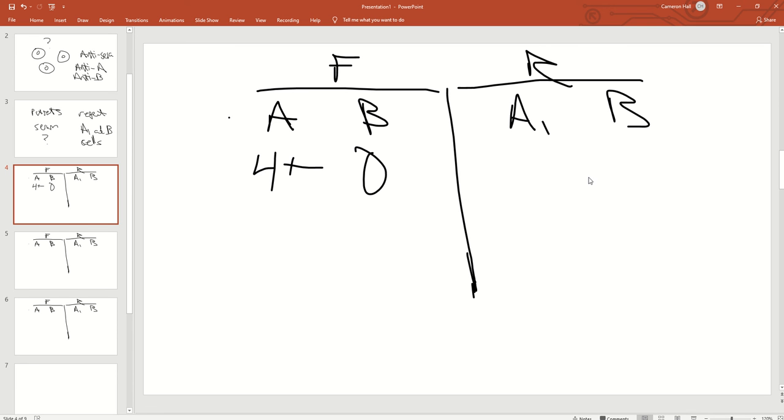Well, let's break it down. So 4+, like I said, means we saw agglutination. So what did we do in the front type? We took the patient's cells and we mixed them with reagent antisera that we know. Right, so A here means that this is anti-A. This is anti-A antisera. Right, so we put the patient's cells in anti-A and we saw agglutination.